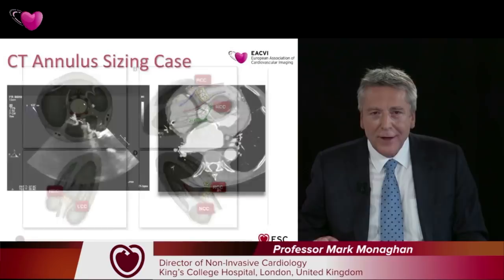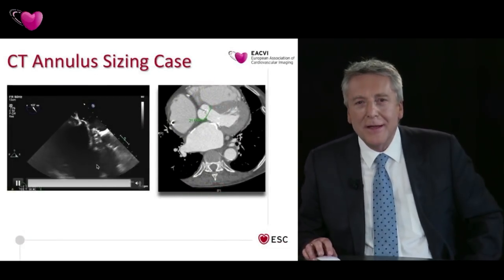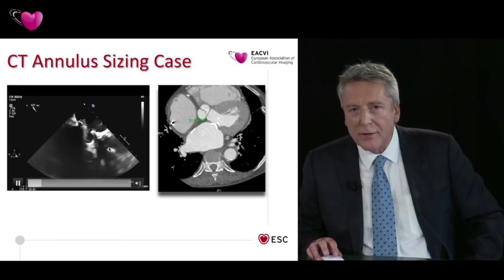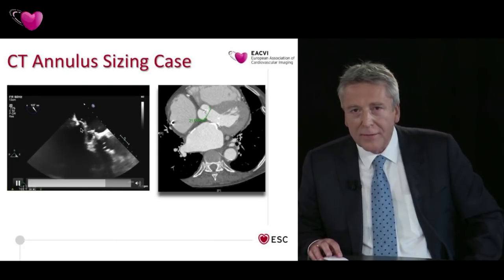Okay, well, again, if I can show some slides, yes, to illustrate it, it might be easier. I'm going to start off with this sort of case here, which I feel a little bit guilty about showing with Mark here. But this is a patient where we really couldn't see the aortic valve very well because of flow masking and of the mechanical mitral valve.